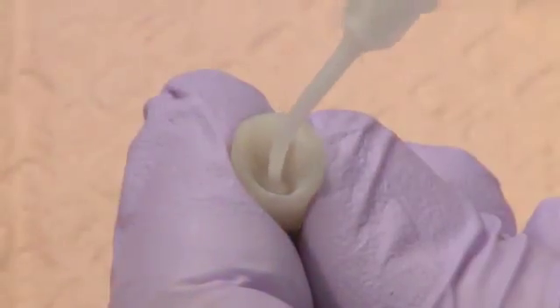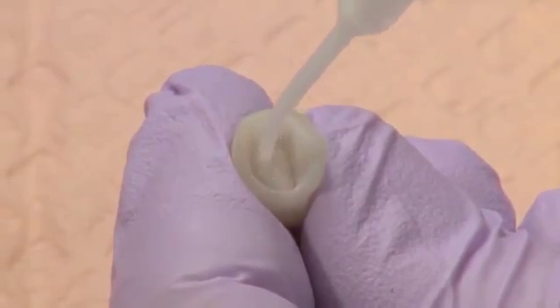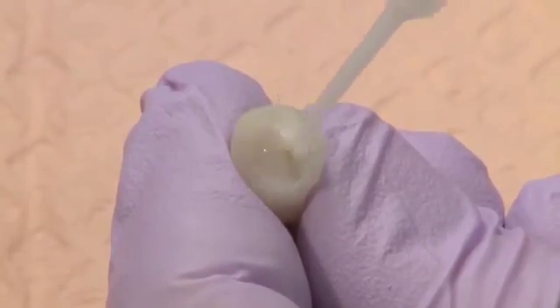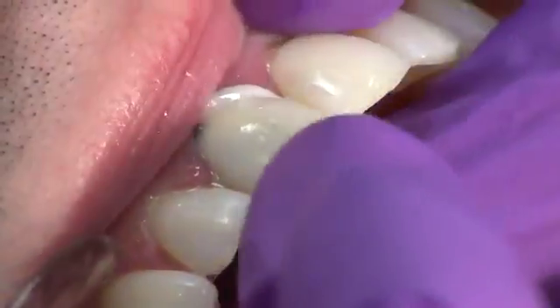Light cure with the Velo curing light for 10 seconds on standard mode. Express a thin layer of Permaflow DC into the prepared crown, then immediately seat and hold in place.